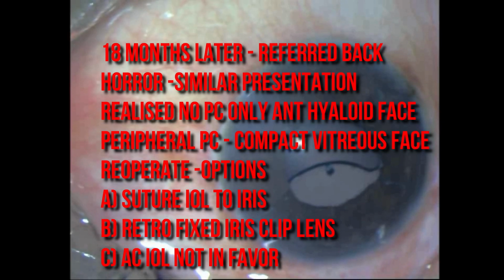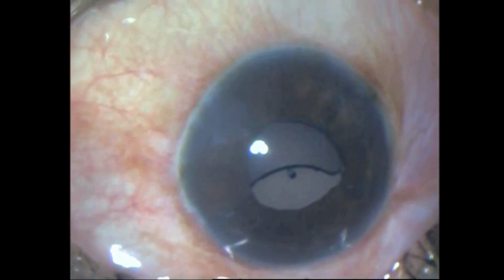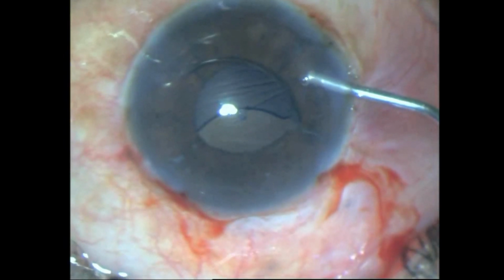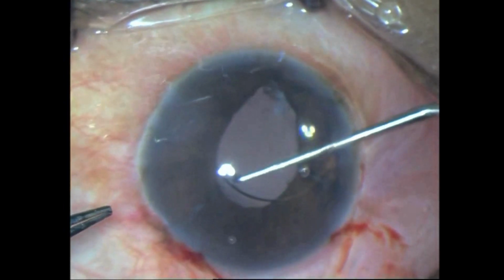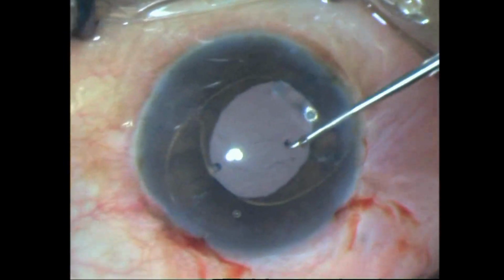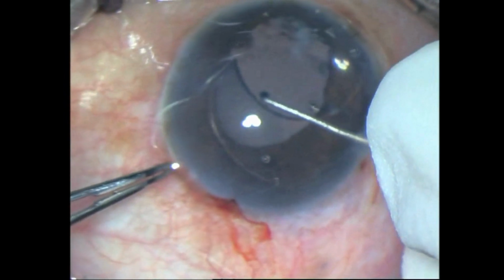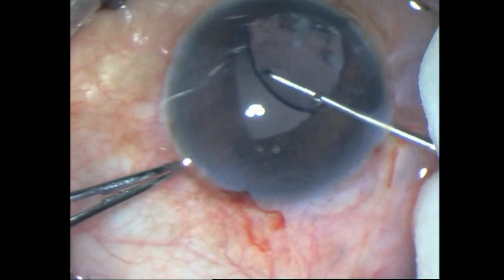There was no PC. In fact, I had put the IOL, as my friend had done, on an anterior compact hyaloid face. So I decided, yes, I have to go in. My first plan was to suture the same IOL onto the iris. So I dislocated into the anterior chamber and very carefully pushed the haptics against the iris so that it will drop into the sulcus. And the other haptic is not so easy, it had to be done bimanually.